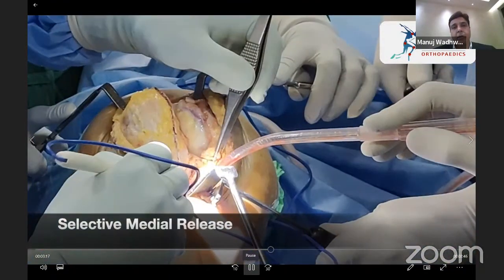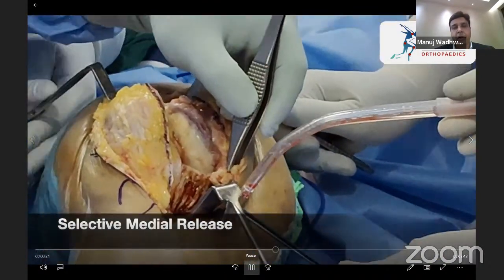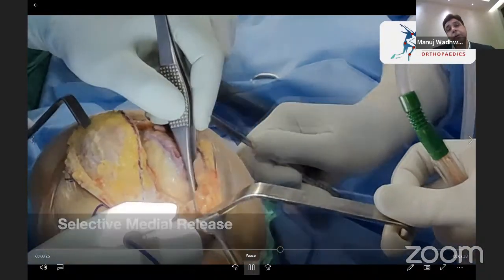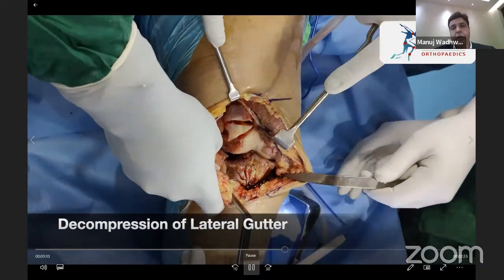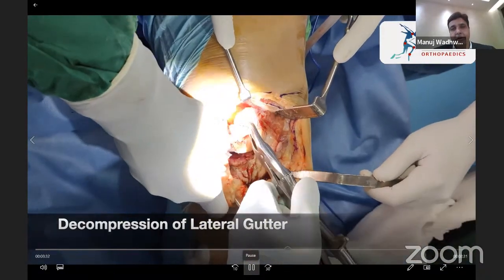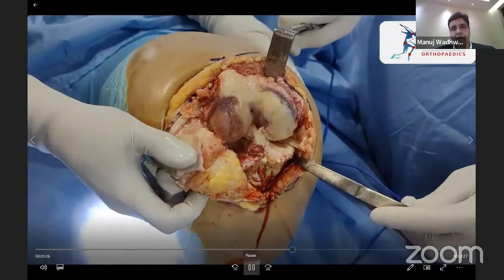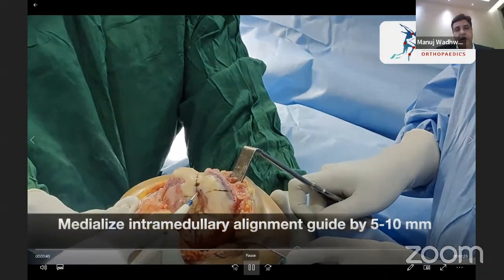So here you can go both medial and lateral. My workhorse is a medial parapatellar approach. I only use lateral if it is a subluxated lateral patella. So a very limited medial release in these cases. Do not go beyond the mid-coronal plane. Clear the lateral gutter. You have to decompress it, take out all osteophytes on the lateral side, and release the tight structures, the patellofemoral ligament, on that side.